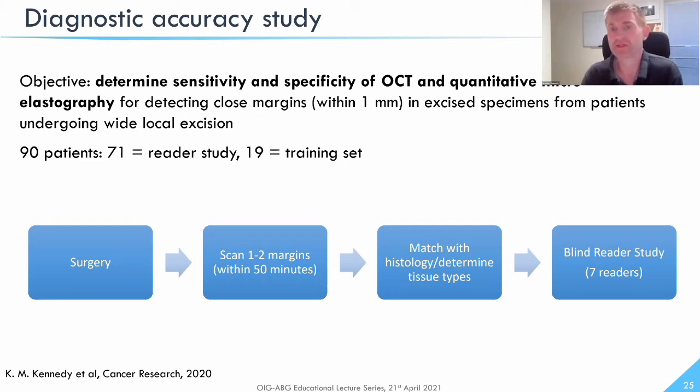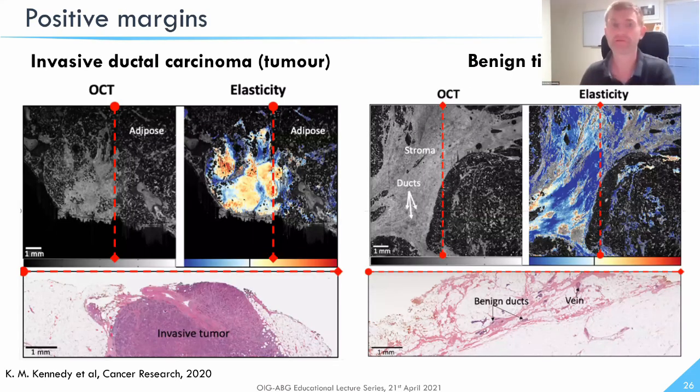So here are 2 images which are representative images from that study. In this case, we can't determine how the histology is performed. They perform cross-sectional histology, which is in the plane that's orthogonal to our en-face view. We like to look in the en-face plane because we can see over the largest field of view. Also, this is the plane where we don't perform the axial fitting, so our resolution is highest.